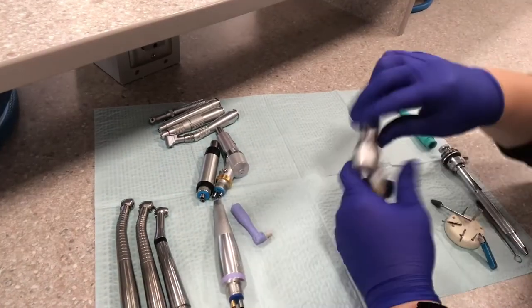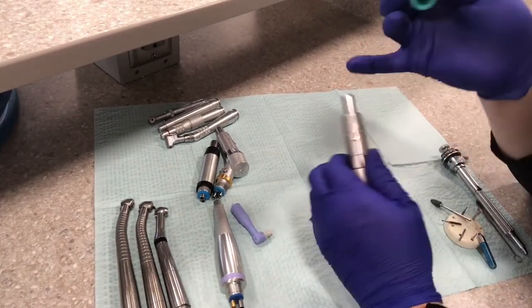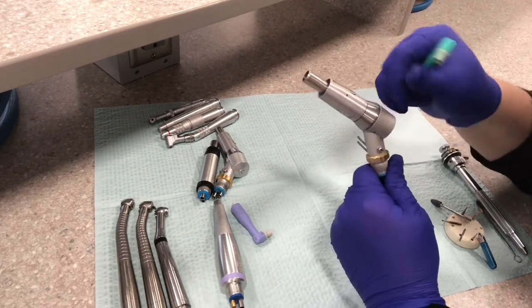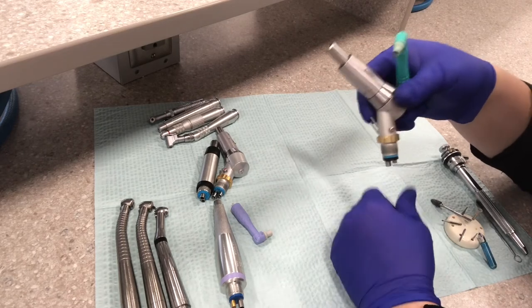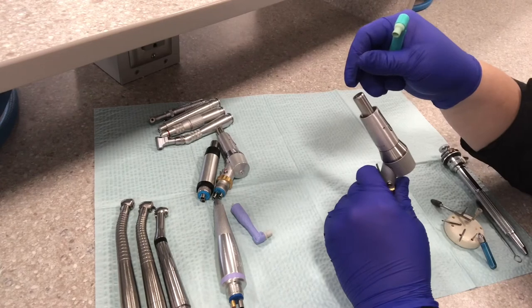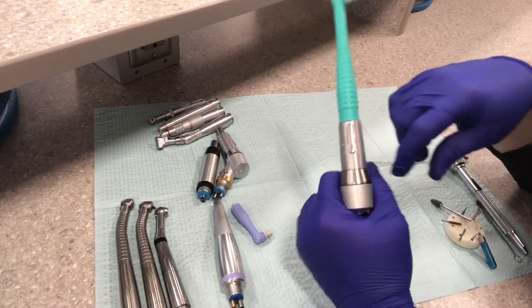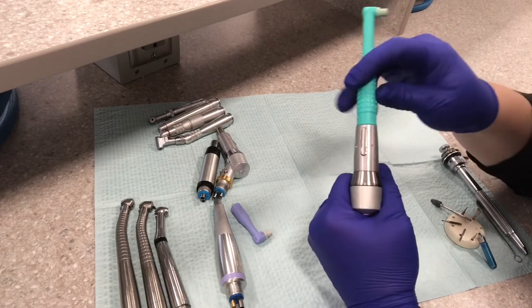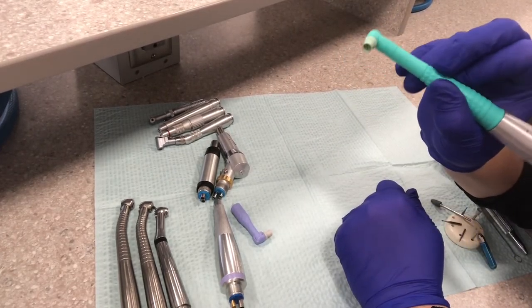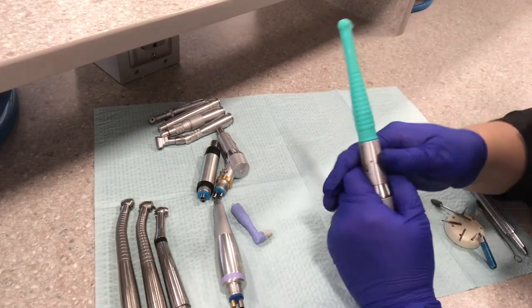Another style is a prophy angle sheath — sheath, remember, you slide it right onto the motor itself. This is the shorty motor, just like the same one used for the slow speed contra-angle or the straight attachment. This slides on and snaps into place — it's locked on — and then it has the prophy angle at the end that you use with the prophy paste to polish the patient's teeth.